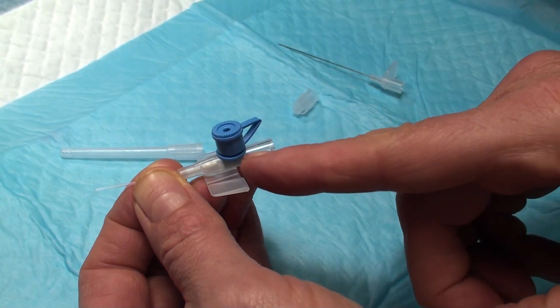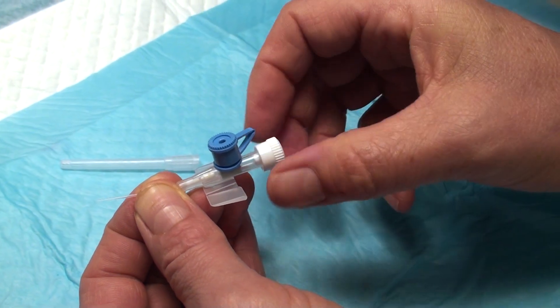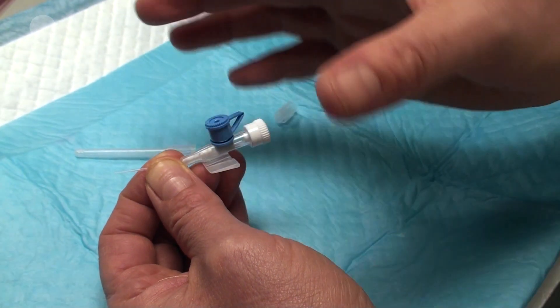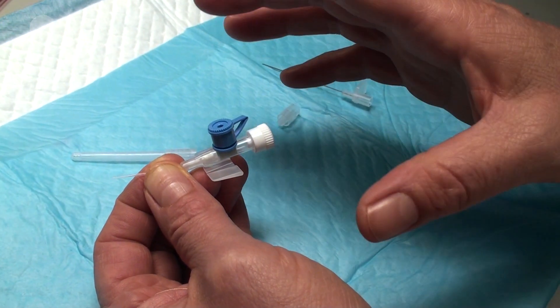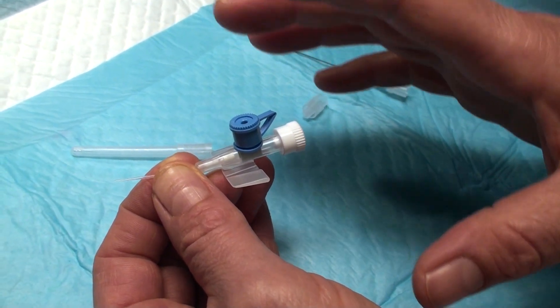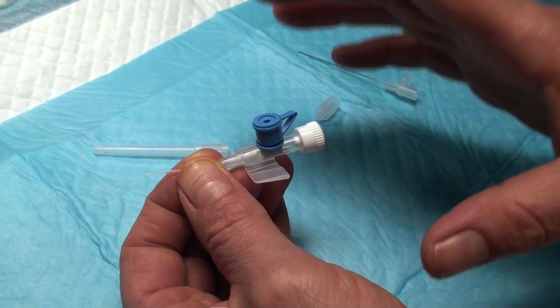Then you allow the blood to fill up its tip, and then you put on the stopper. Then you tape it and test your system with saline. Please make sure that you have your saline ready before you do this.